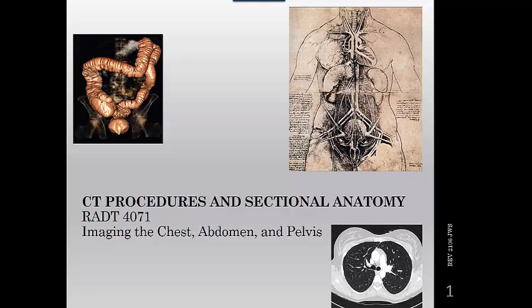Post-processing techniques that we have, such as 3D and multiplanar reconstructions, can accurately display the pulmonary and the coronary vasculature. These new non-invasive CT imaging techniques can augment and sometimes replace the information provided from more invasive tests, such as aortography, pulmonary angiography, and coronary angiography. So we're getting pretty close to this gold standard with CT.